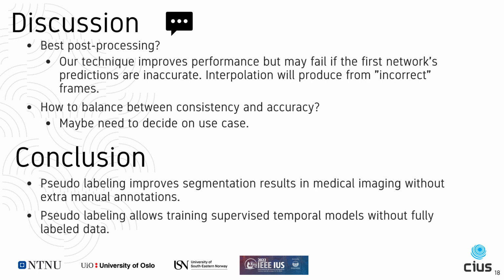Another problem is how to balance between consistency and accuracy. There will be a slight compromise on accuracy to have better consistency. Maybe we need to decide based on the use case.